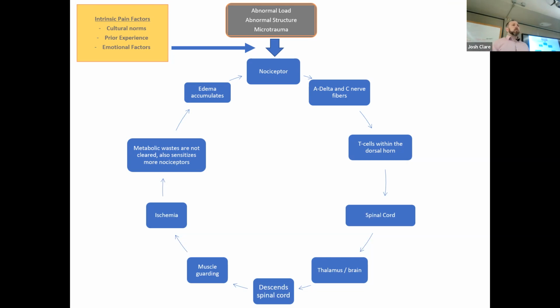I'll get back to that. Anything else? Clearing metabolic waste, definitely. How about non-thermal, where the duty cycle's at 20%? Potentially at the edema and probably the metabolic waste. That's really at the cellular level we're driving that stuff. Now, the other great thing about it, the benefit, I think, and this is a personal opinion, I think the benefit of ultrasound over laser is the non-painful stimulus.